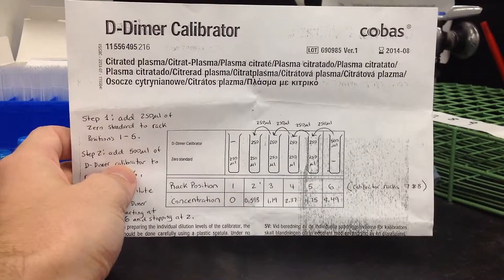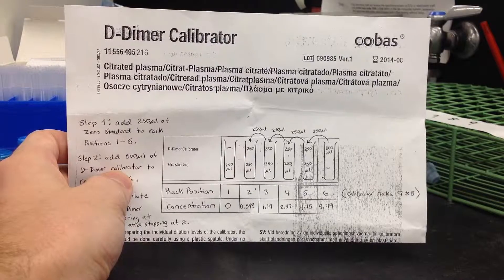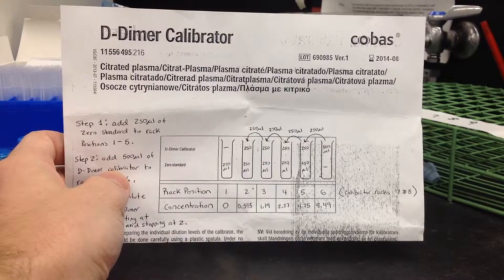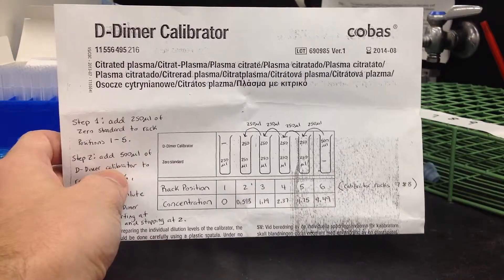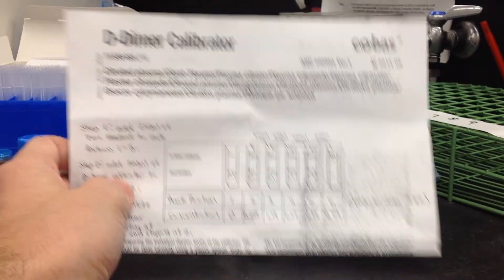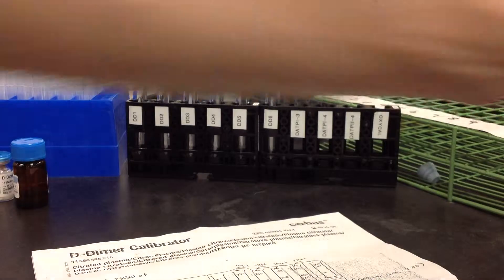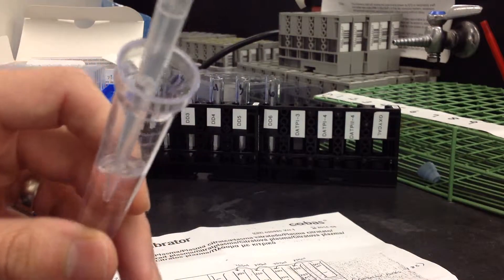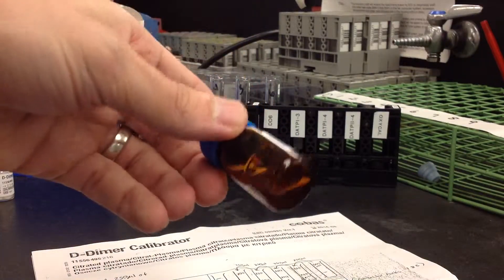I'm going to start as if I had already reconstituted everything I needed. I'm not going to actually do this, but I'm just going to use water to represent everything. So once again, this would be my pretend D-dimer Calibrator 1, which is the zero standard — the one that's already reconstituted. It's a liquid in the box. Using the guide, I'm going to start by adding the zero standard to my tubes. Tubes 1 through 5 get the zero standard. Tube 6 has a little line — that means it's not getting the zero standard, because that's going to be our 100% D-dimer Calibrator.